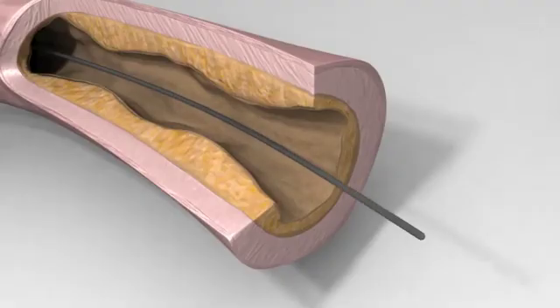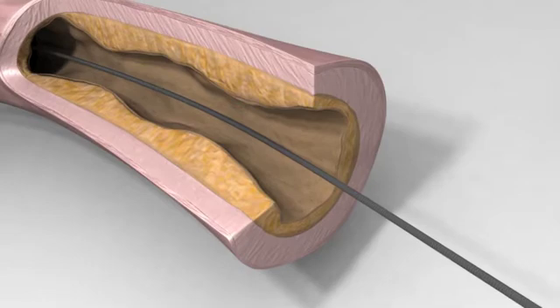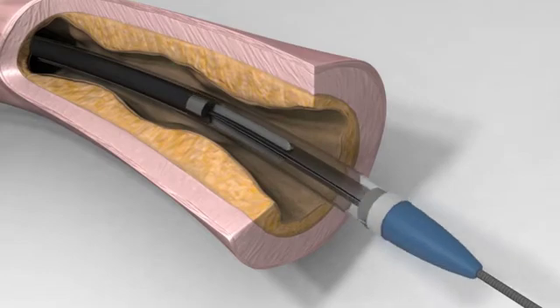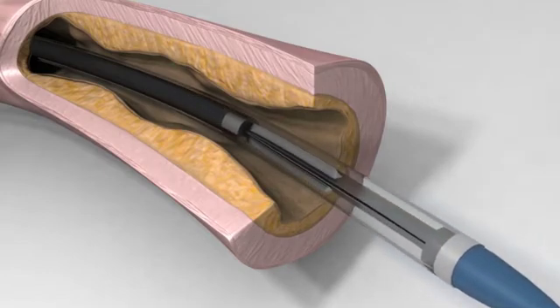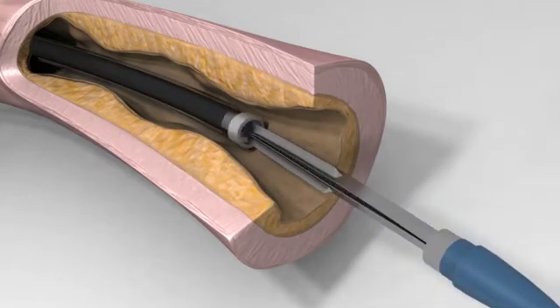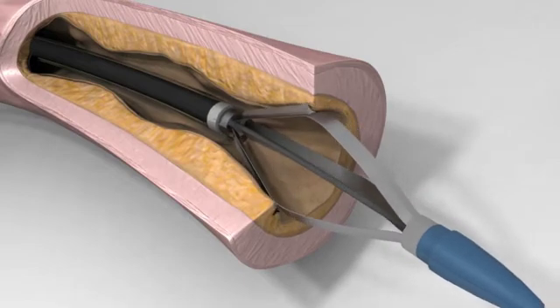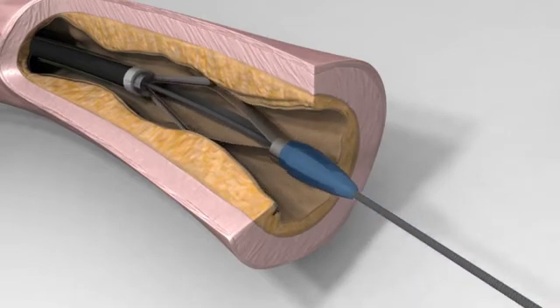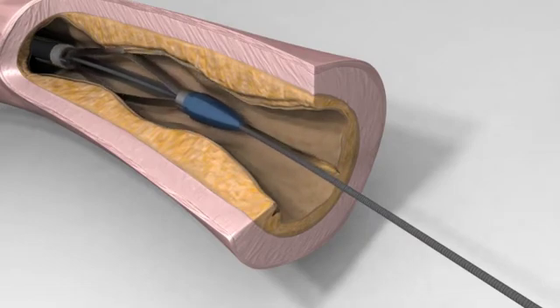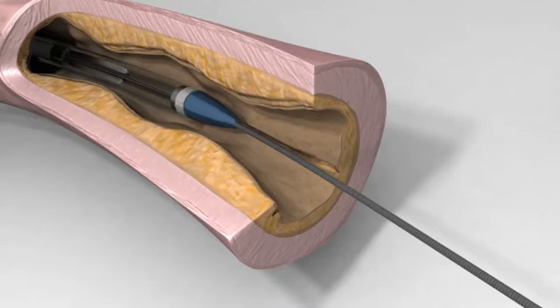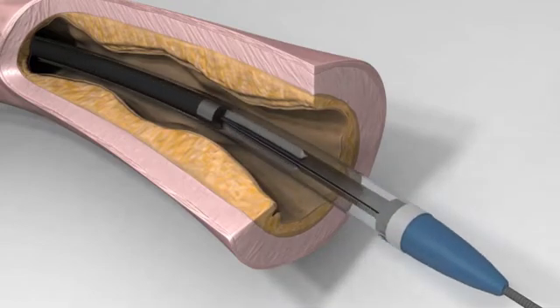Here is the Flex device. It is a device that has blades on it that is actually self-expanding with a system. You can expand these blades to any lumen that you choose to expand it to. You will see the blades coming out, and it depends on how much you want them expanded out, you can then do that.